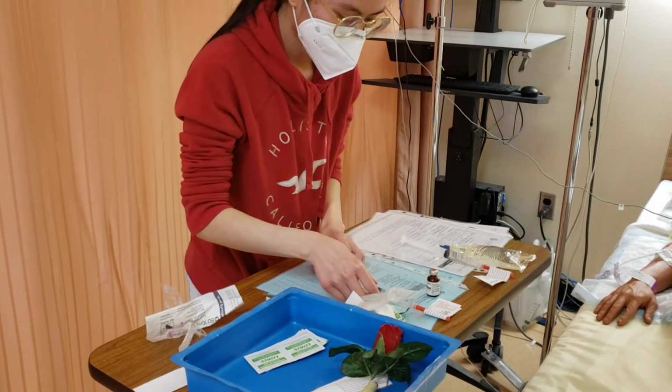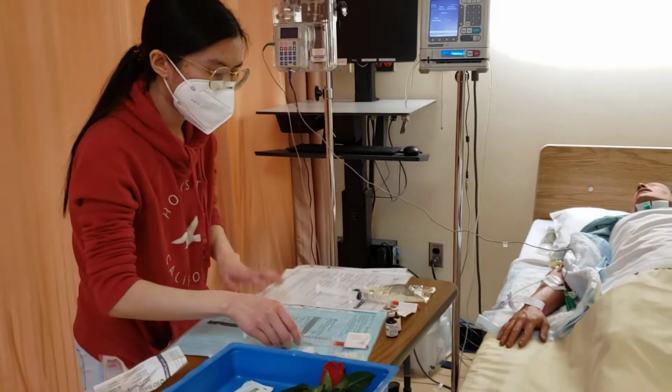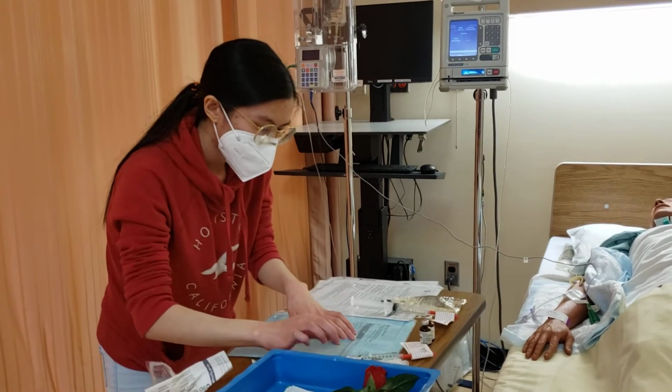I ask the second nurse to confirm everything is correct. So I would need to get a second nurse to check this with me. I'm going to do my second check.